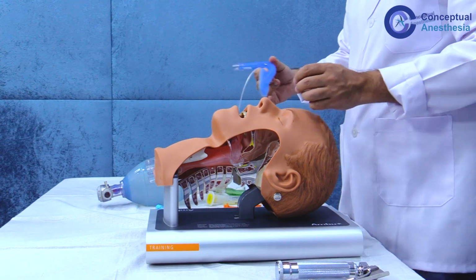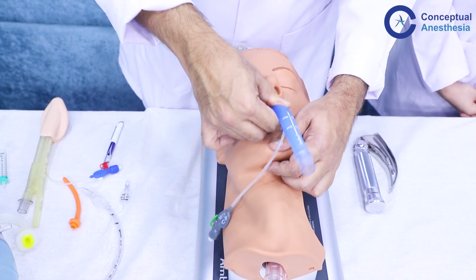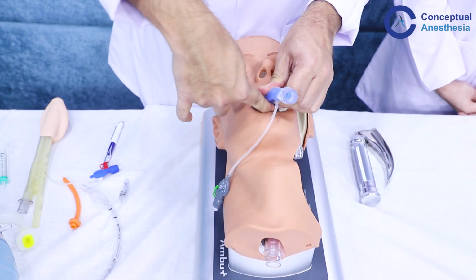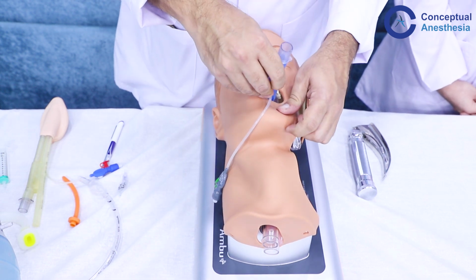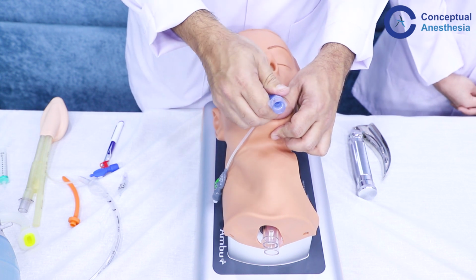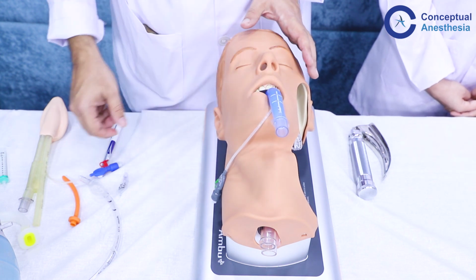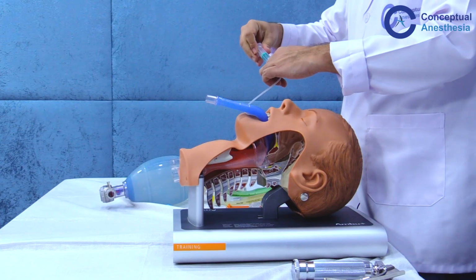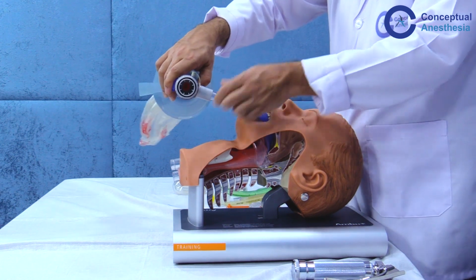So now we can insert the supraglottic airway device. Again, open the mouth and flatten the cuff against the hard palate and then introduce it. You can push the LMA inside. Once the LMA is inside, we connect it to the ventilator or to the AMBU bag. But before doing that, you have to inflate the cuff of the LMA as per the recommended inflation volume as per the size of the LMA. Now, we are inflating the LMA, and then ventilating the patient.